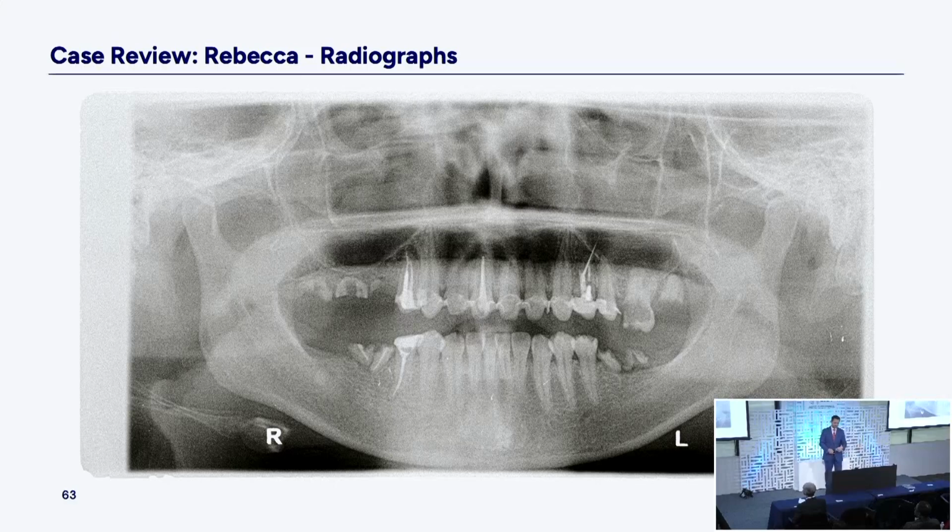We have an x-ray of the temps in place. You could see we're going to lose number 12 because someone did a root canal and put a 3-foot filling in it. So it's got that poke. It goes through the sinus. It's a sinus drainage system too. So you have a lot of things. You can charge extra for that, I hear, when you do the root canal filling if it drains your sinus as well. So you have to do extra fees on this. I don't know what the code is, but that's later date.